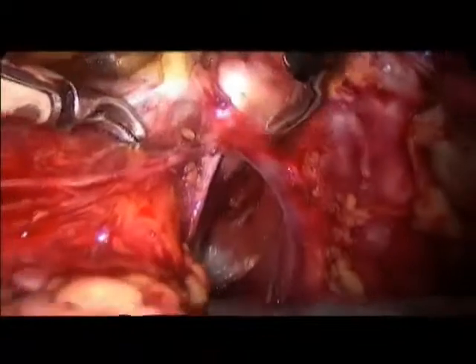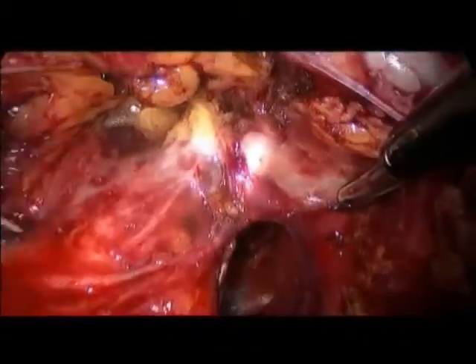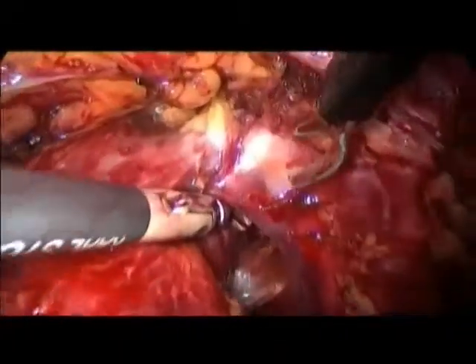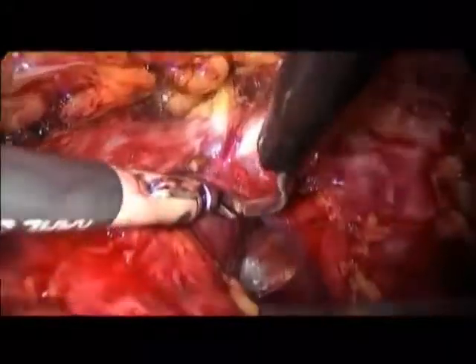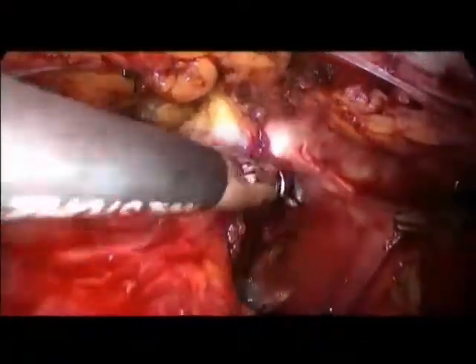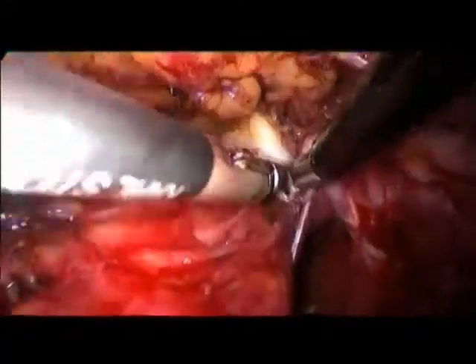Oh, it's not bad. It's here. Nothing to see. And I will soon have to divide slightly the puboprostatic ligament in order to proceed with this dissection, because as you can see, the apical coverage is very wide in this patient.